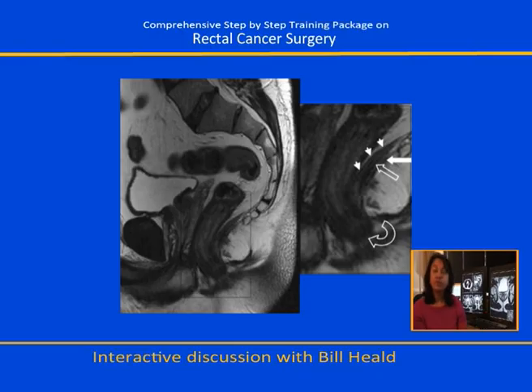I think more important clinically have been one or two cases where there have been downward extensions of tongues of tumour, perhaps, that have been missed on radiology, but without any particular effort on his part, the surgeon doing a rectal examination in such a case will pick up any tongues of tumour extending distally. So I think the rectal examination really is very important.